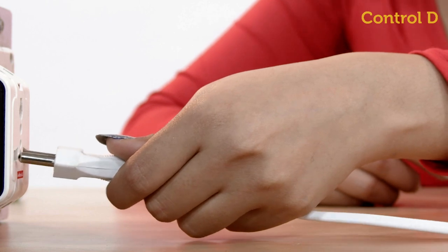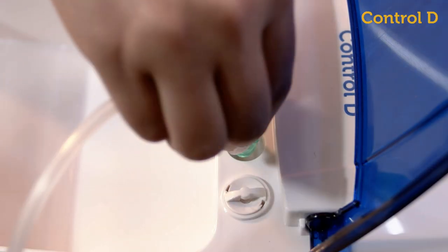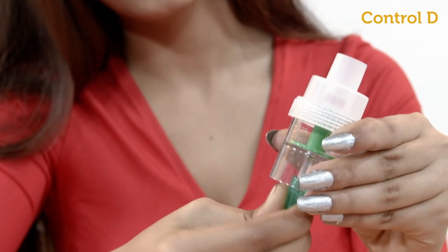To get started, connect the main unit to a power supply. Connect the air tube from the nebulizer to the medicine chamber securely and tightly.